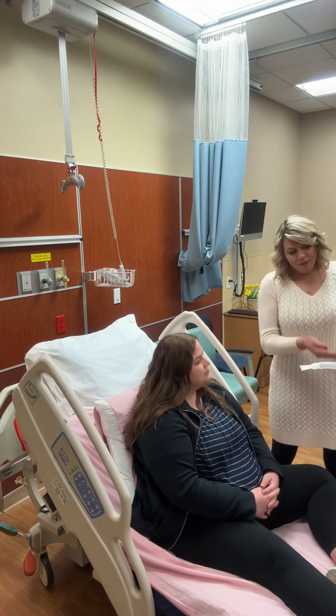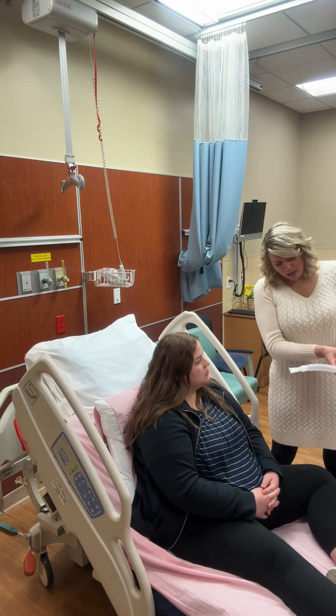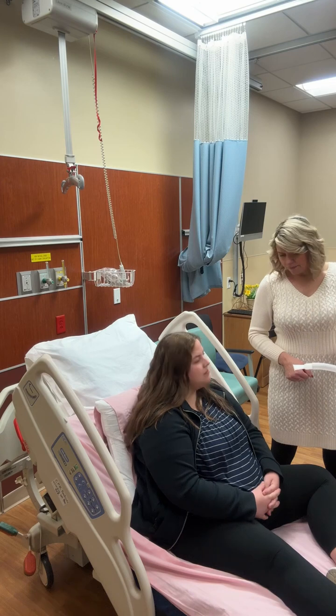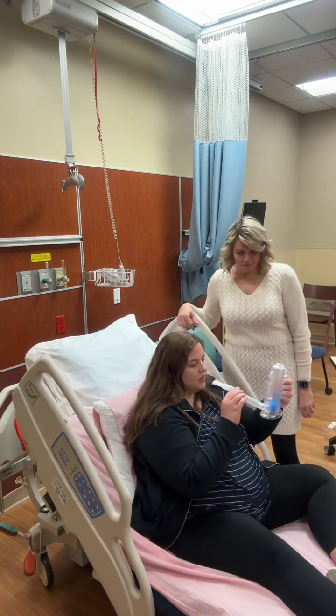If you don't hit 1250 right away, that's fine. We can start down here and work our way up. The goal is to just improve. Okay, so why don't you try that? All right. See if you can do what I told you to do.